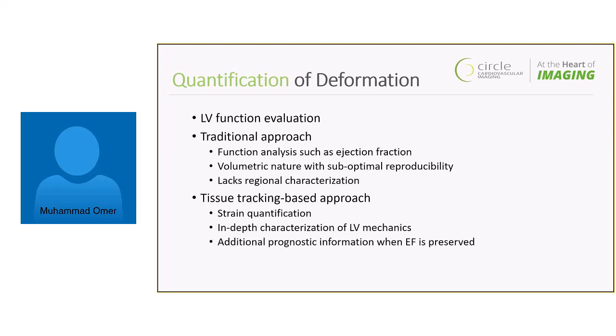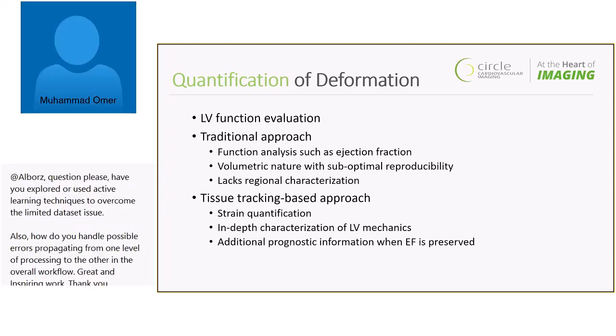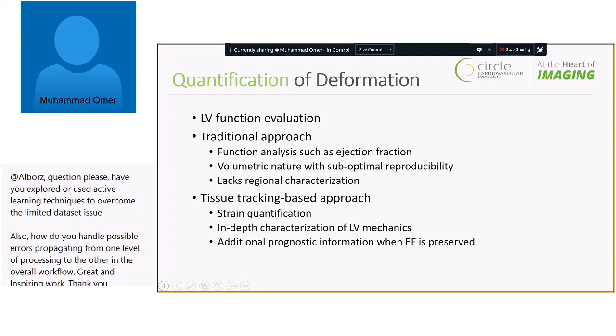In order to overcome these challenges, there are new strategies based on a tissue tracking approach, where markers are considered along the muscle of the heart, and that is tracked over time in order to see the functionality of the heart's contraction.